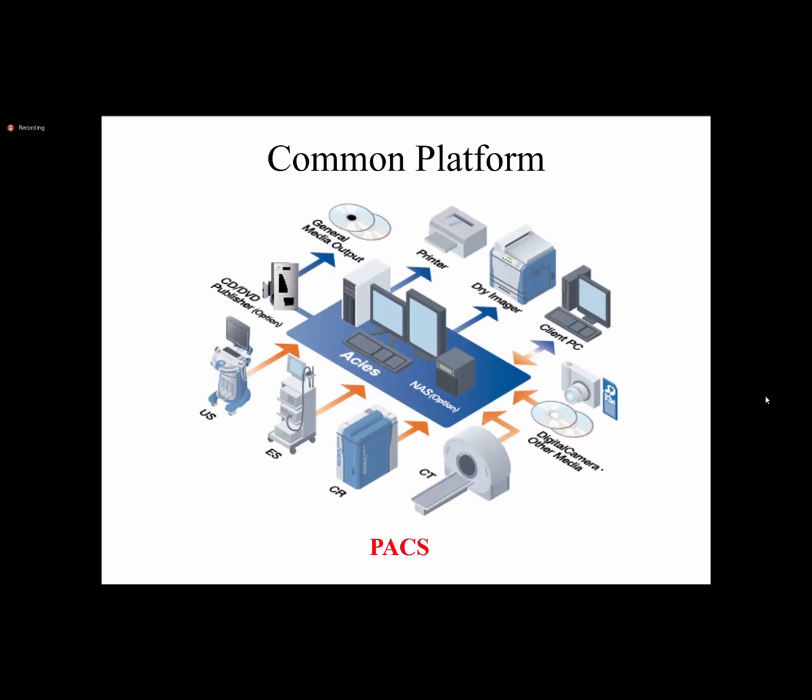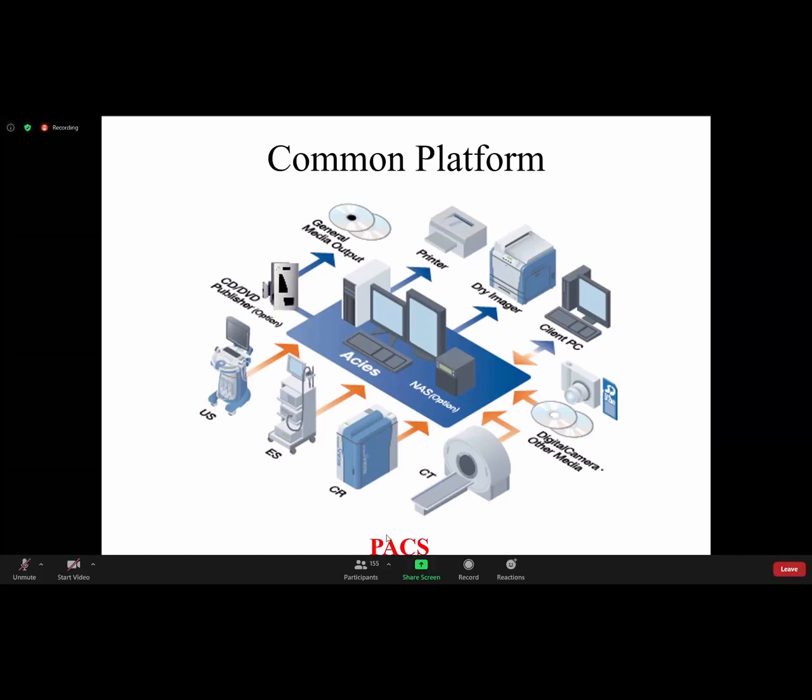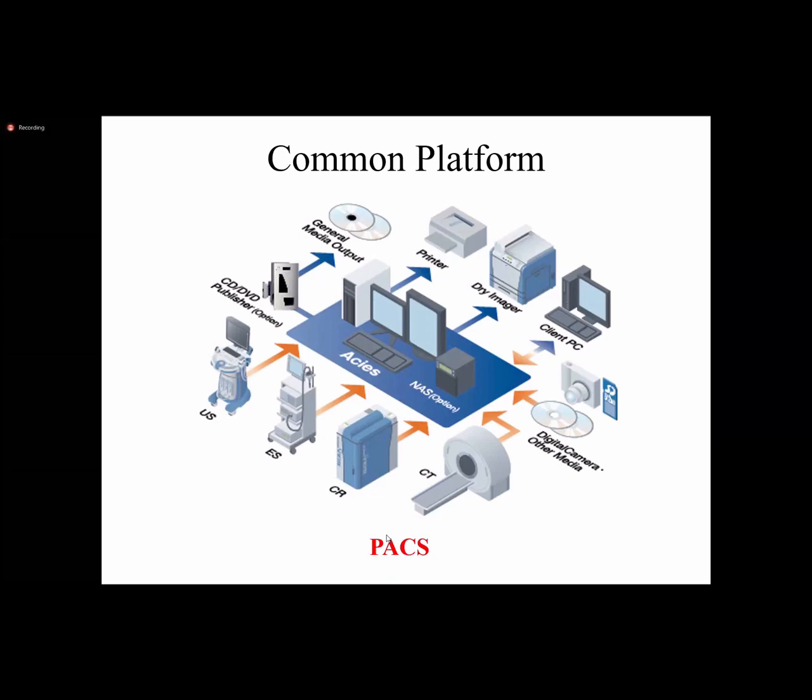PACS is a common platform. Through the PACS system, we can access all kinds of data in the radiology department as well as in the different wings of the hospital. We can connect the sonography equipment, echocardiography equipment, X-ray equipment, CT, MRI, DEXA, whatever imaging equipment we have in the department, with the PACS system.